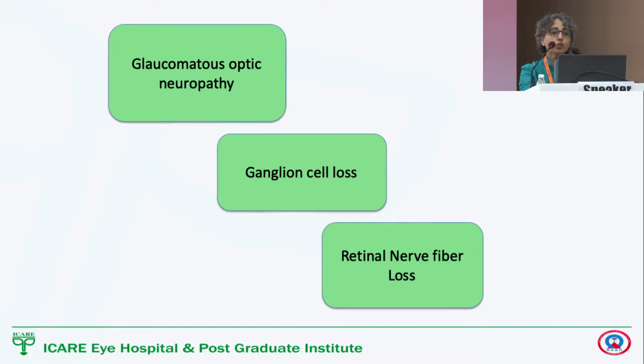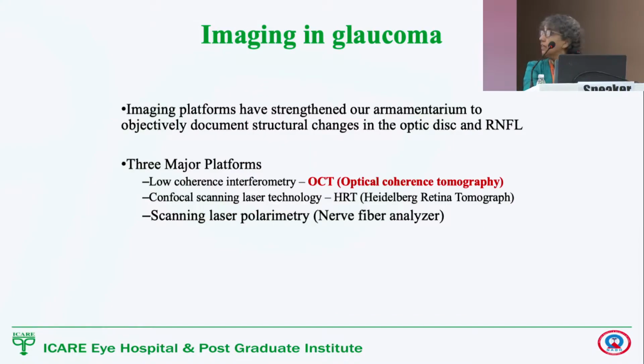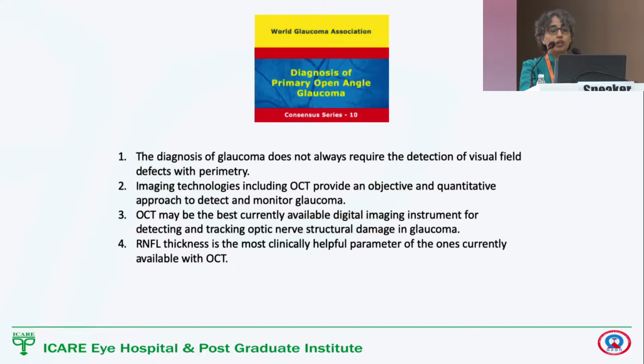And we also know that the imaging platforms are becoming more and more popular to document the structural damage that we see in glaucoma. And over the years, OCT has replaced all the other equipments that were available in the market, like the GDX and the HRT. Now we are all primarily using OCT in our clinics to diagnose glaucoma. So I will basically be talking only on that.